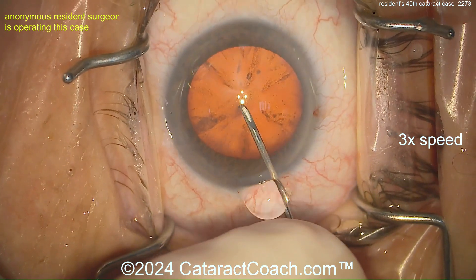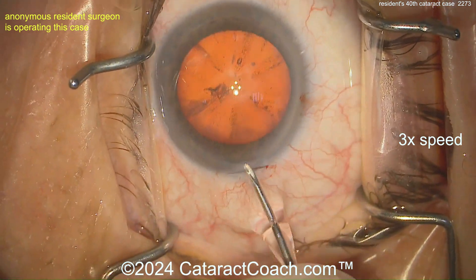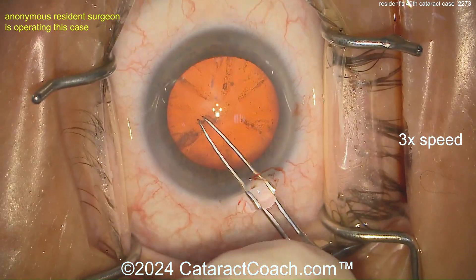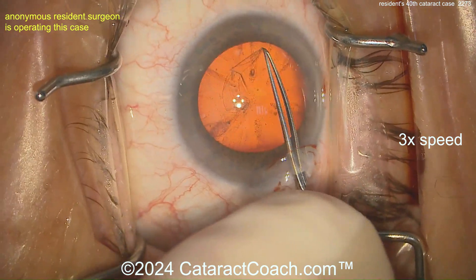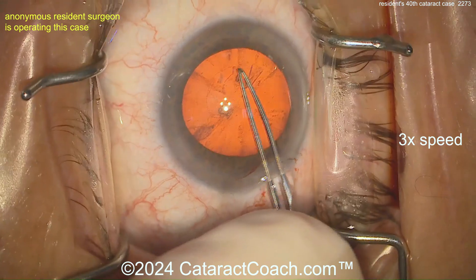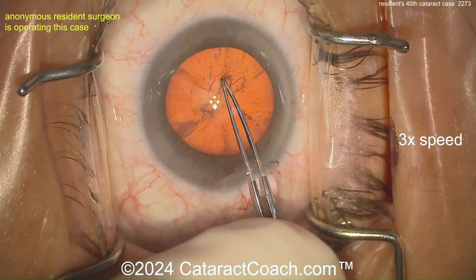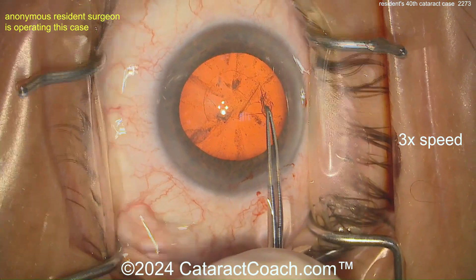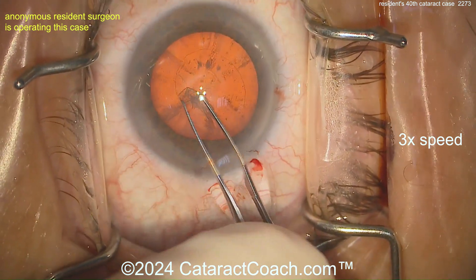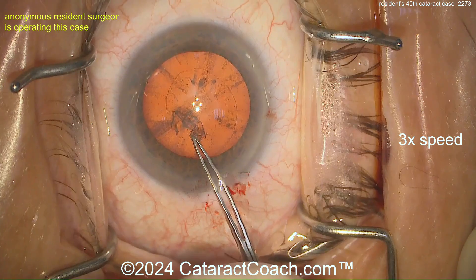Now let's start the rhexis. Rhexis is going in — it's pretty common for a resident to be told to start the rhexis. Getting the rhexis done with pretty good technique. Normally the homework of a resident is to grab it every clock hour, so 12 times to get the full 360. This resident is doing a pretty good job.